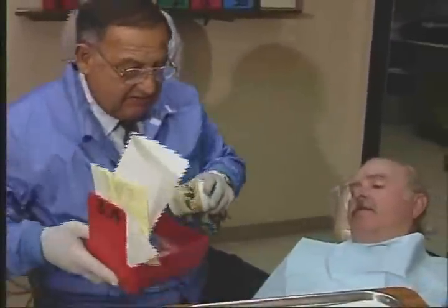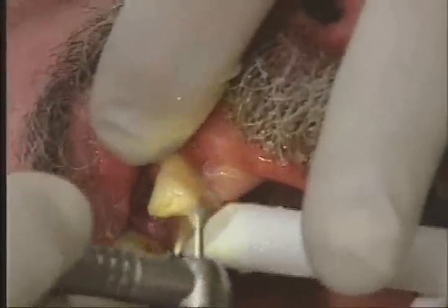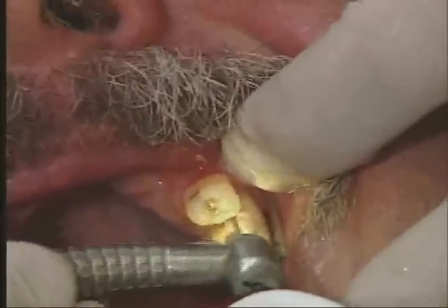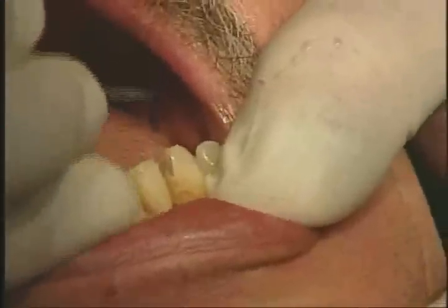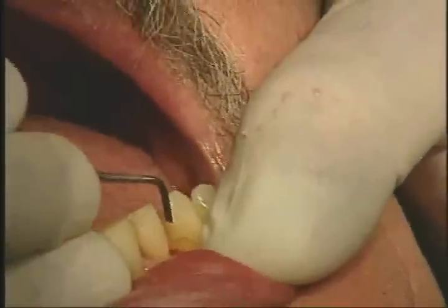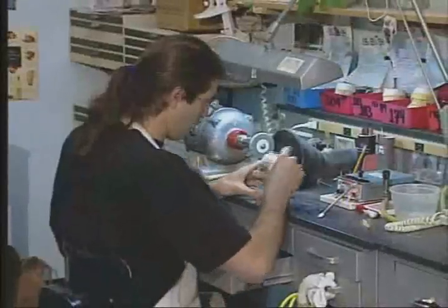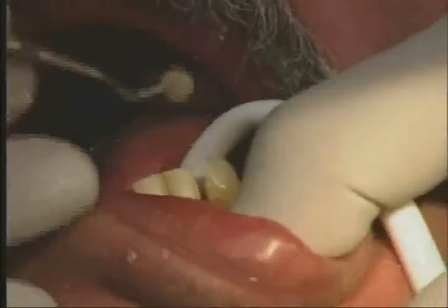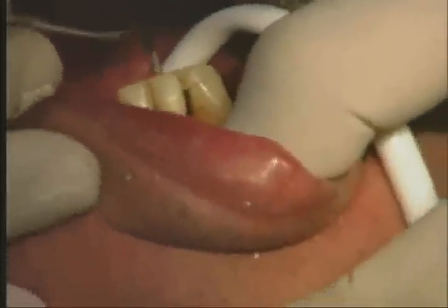Visit 2: After determining the abutment teeth and examining the study models, equilibration of the mouth must be performed before taking the final impression. After equilibration, the interproximal access areas are created, all rests are prepared in the prescribed manner, and contouring of the abutment teeth is done if necessary. A final impression is then taken with a hydrocolloid material or alginate and poured in your office in a yellow buff stone. A bite registration and counter model are taken and sent to the certified dental laboratory for your Equipoise framework to be cast. Before the patient is dismissed, the interproximal space must be preserved by placing a light-cure composite in the area.